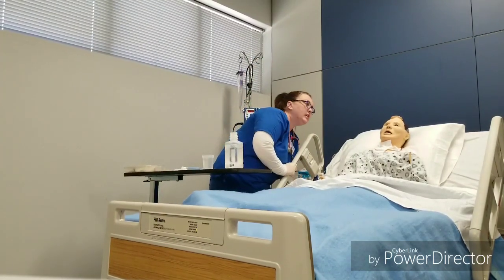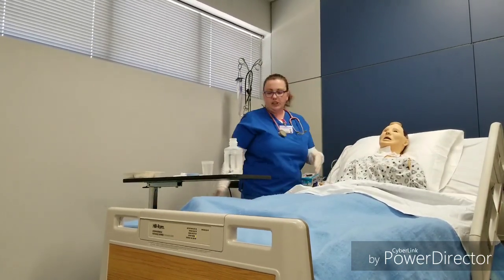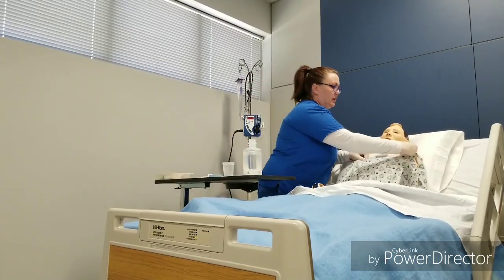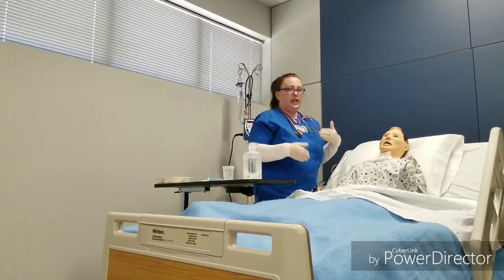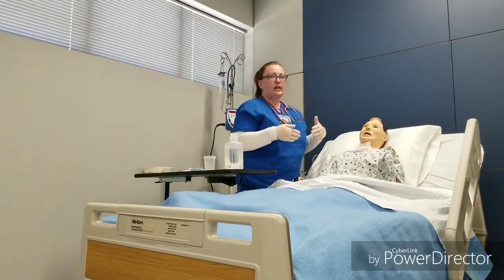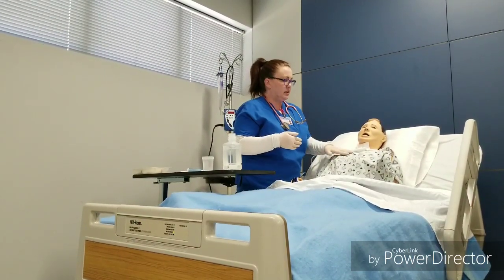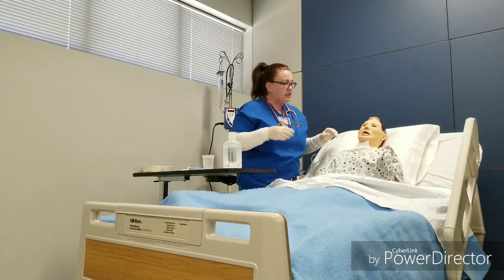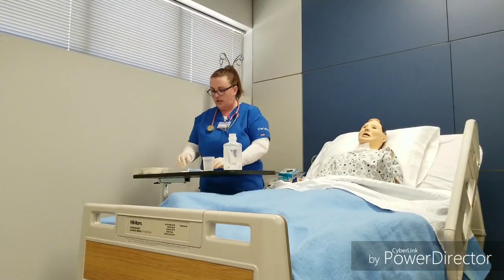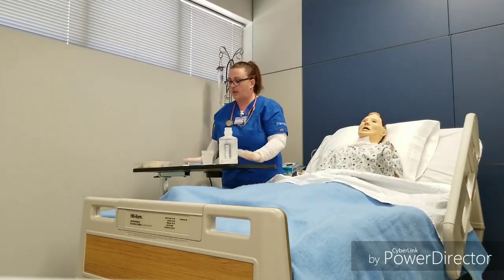I'm going to put the bed rail down again for this, just so I can reach the patient better. If the patient is able to take some deep breaths on their own, have them do it about 3 times. That way they can get good and oxygenated before you do this. So, all right, Mr. Smith, I'm going to suction your trach now. All right, here we go.